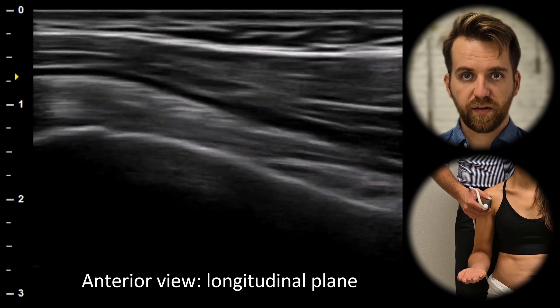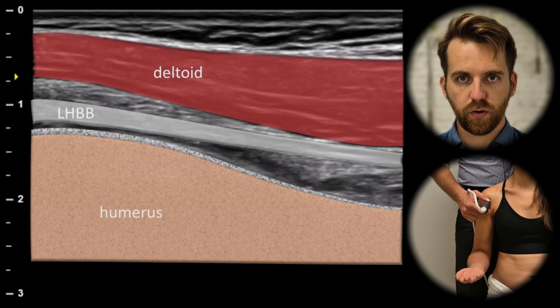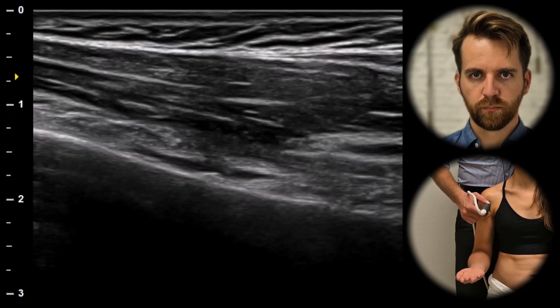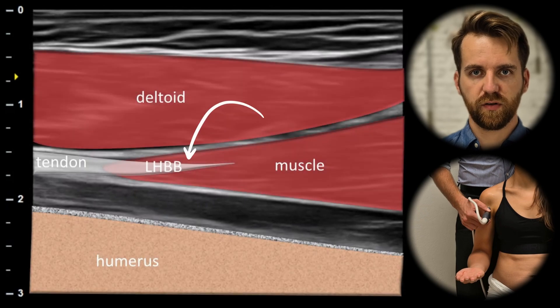When we rotate the probe by 90 degrees, we can see the tendon of the long head of the biceps in the long axis. We can also follow the tendon distally to the myotendinous junction.